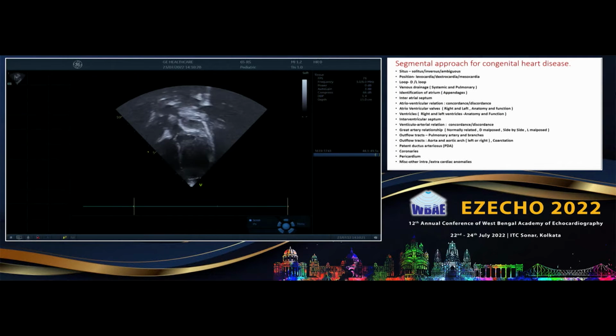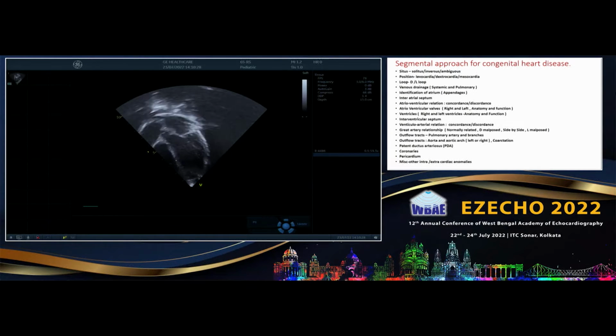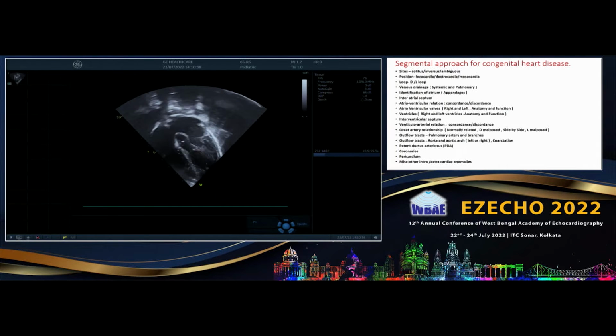So she's showing the coronary. We can see all sorts of vascular attachments. Anything coming out from the left-sided heart may or may not be the aorta. So she's trying to show that the origin of the coronary artery is one of the very sure-shot points, by and large, that it is the aorta. Then more sweep, more tilt.